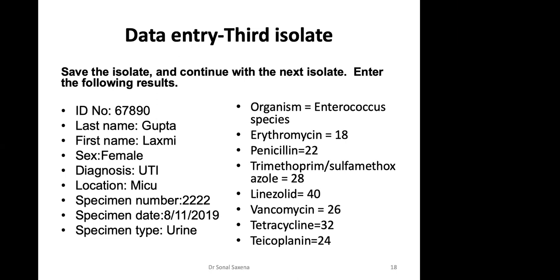Very, very important point. Another point I'd like to highlight is that the minute you get an alert, like a CRE, the first thing to be done is to communicate with the clinician to find out: is it really the bug sitting inside the patient, or is there a problem with the collection?